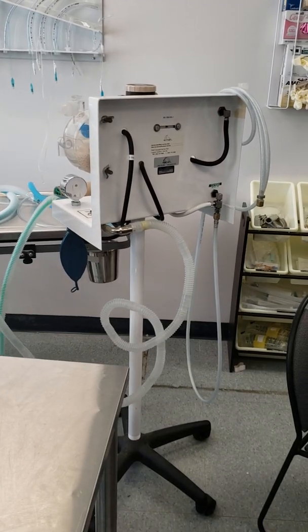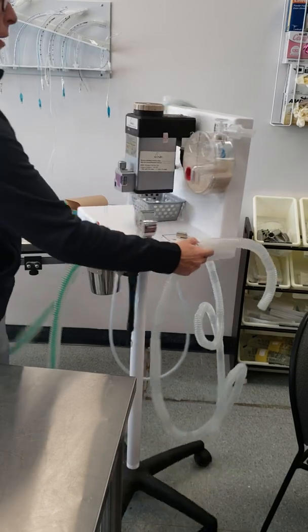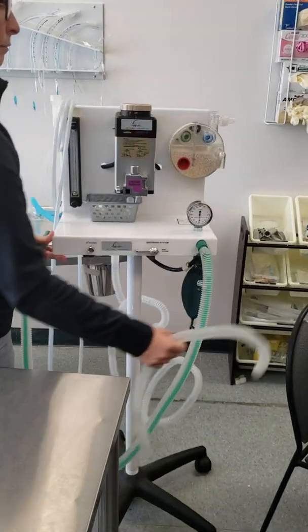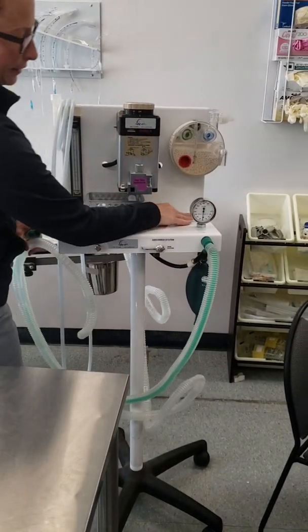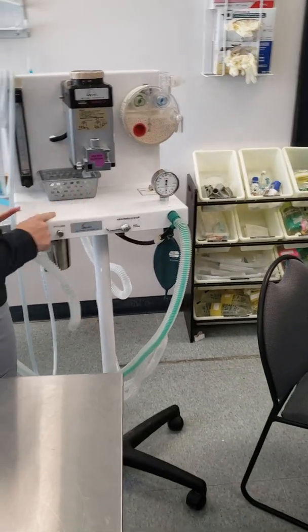Okay, questions about the non-rebreathing side? Where's my pop-off for it? Is it the one in the back corner? Yes, it's this. So my pop-off for this side is in the back here. And you always want to make sure that's set half full.